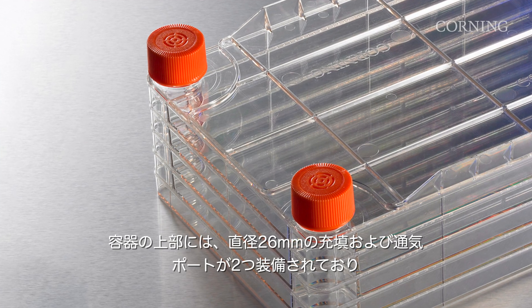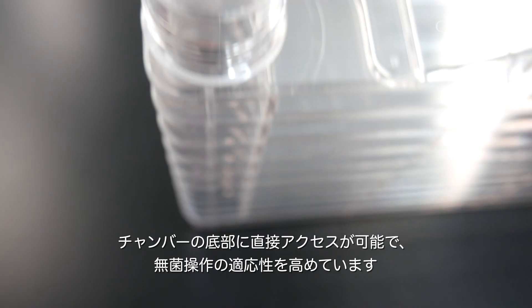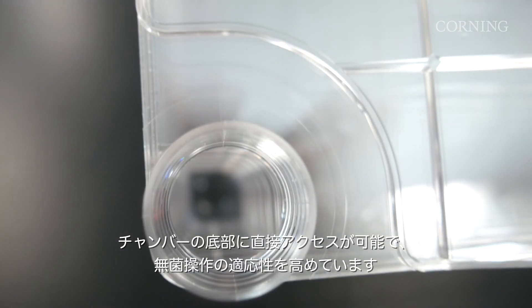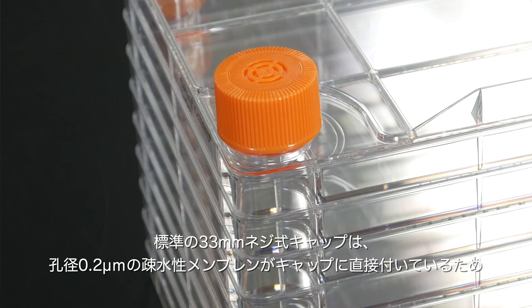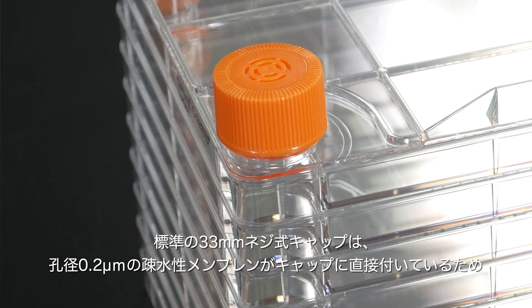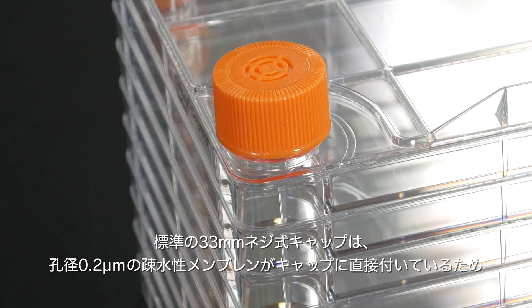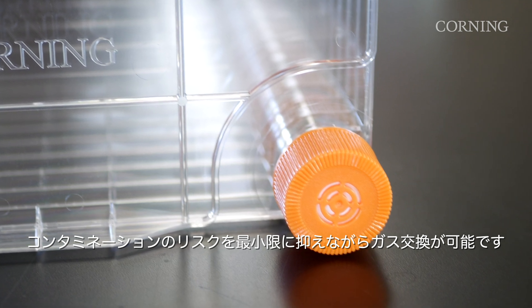The top of the vessel is equipped with two 26 mm diameter filling and venting ports, which provide direct access to the chamber bottom and allow for greater flexibility during sterile manipulations. The standard 33 mm threaded caps feature 0.2 micron pore size and hydrophobic membranes sealed directly to the caps, allowing gas exchange while minimizing contamination risk.